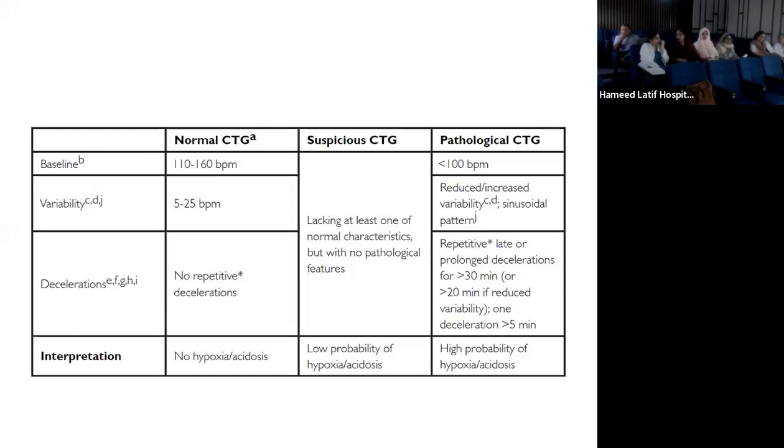So the more dilated she is, the easier it is to do. But people were forced to do such a thing at 3 centimeters, which was quite nerve-wracking. So I think that's why they are slowly shifting away from this nonsense now. And this scalp thing, 25 seconds is the best thing to do.